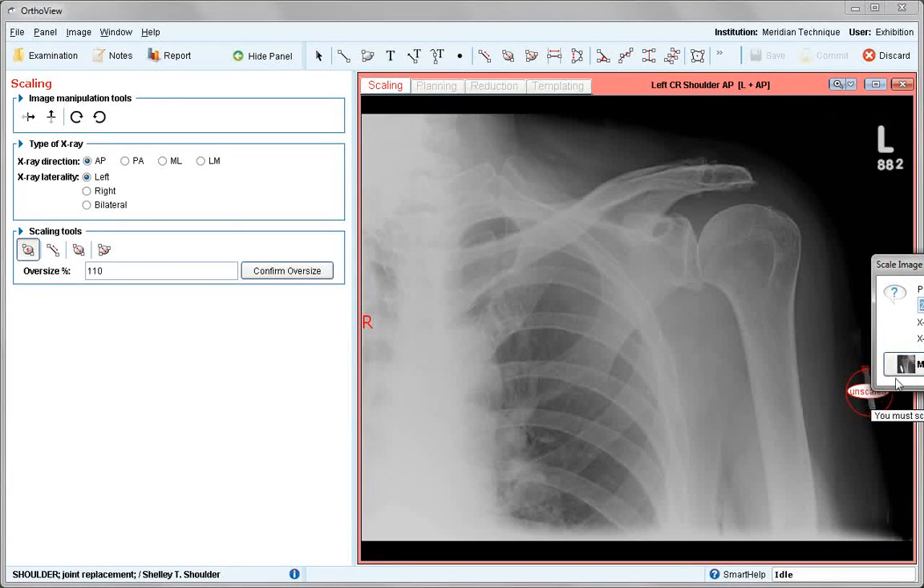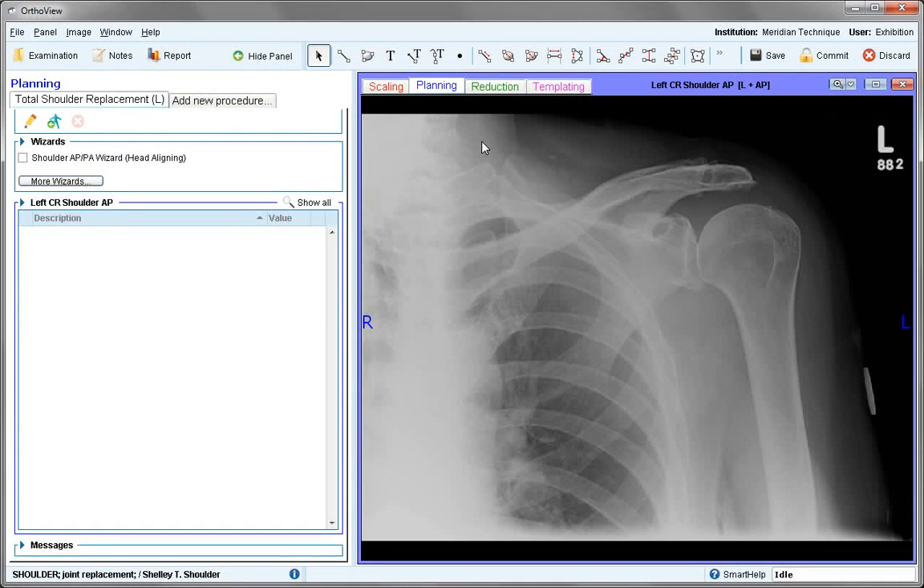Click on the marker to scale, confirm it's a marker and we're in planning. Choose the total shoulder wizard.